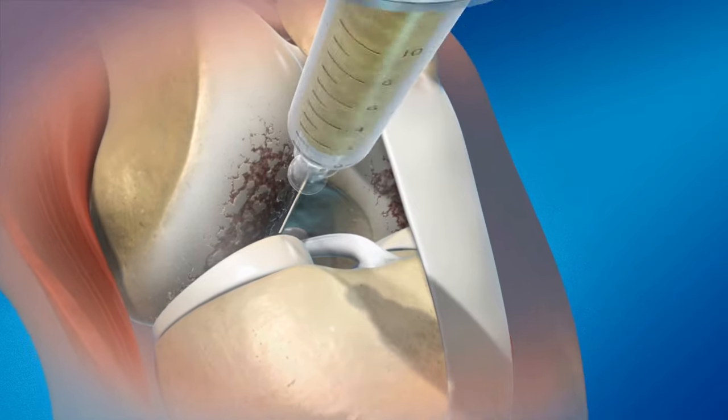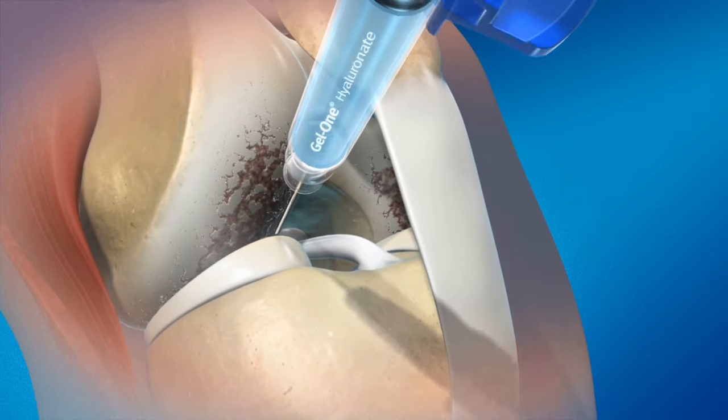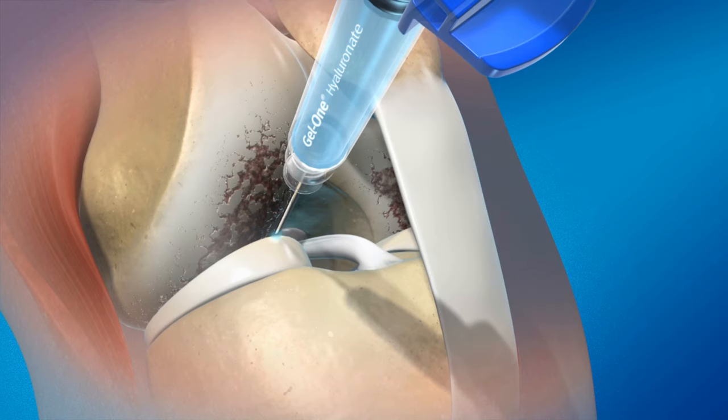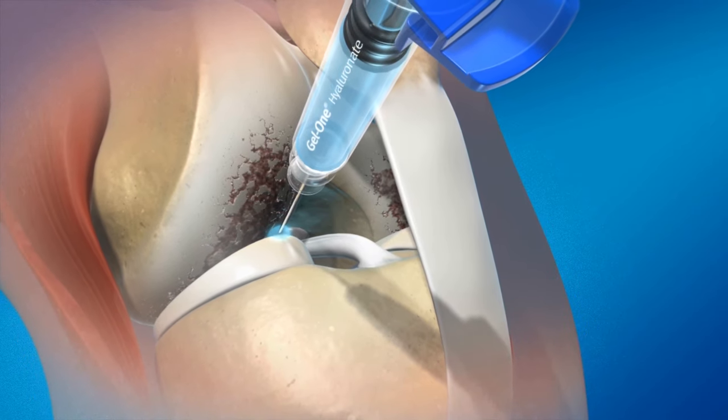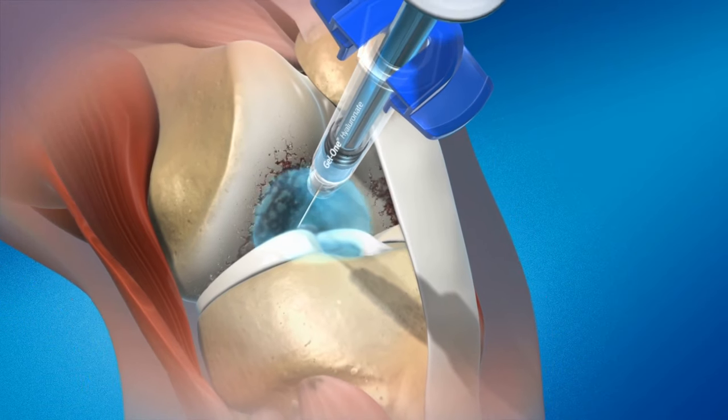Using strict aseptic technique, attach the syringe containing Gel 1 Hyaluronate to an 18-20 gauge needle and inject Gel 1 through the anterolateral port. If aspiration was performed, use the already placed needle.